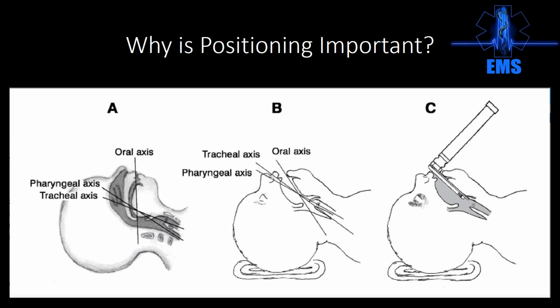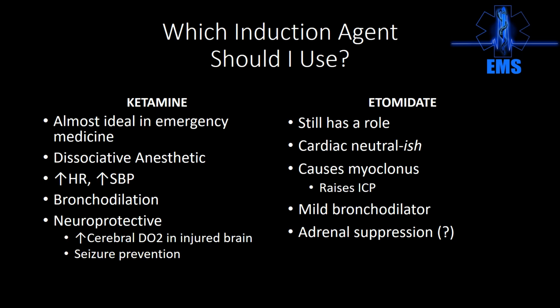Now I know what you're thinking. What about trauma patients? This kid's head's relatively extended. Take a look at these patients here. These patients are largely in the neutral position. They're not hyperextended. So this is still accomplishable for patients who have C-spine immobilization.